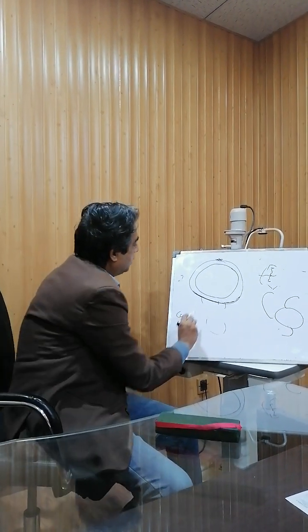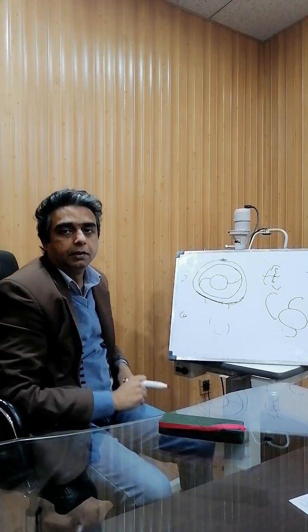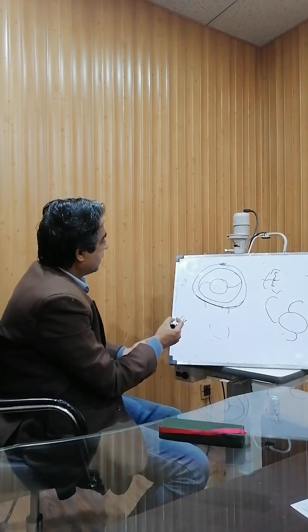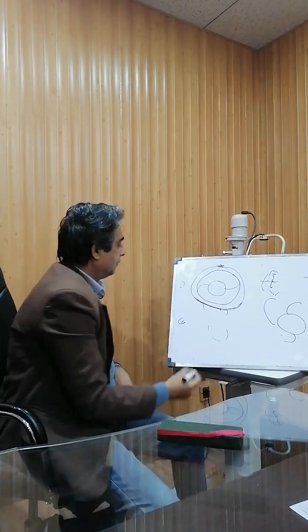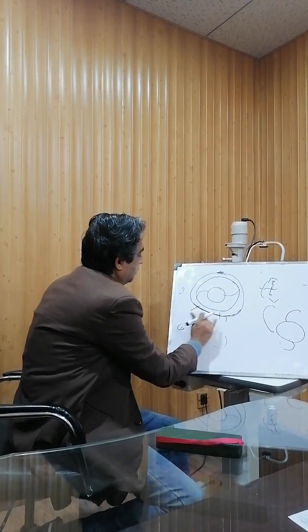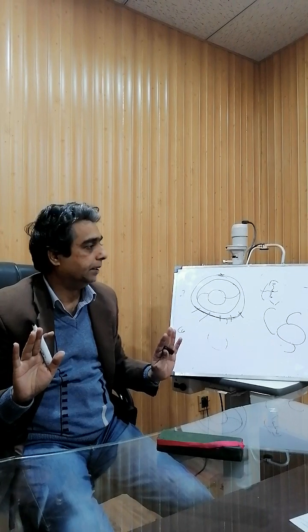We will put this artificial lens into the eye, right? We will put miochol or carbachol, which is parasympathomimetic, like pilocarpine drops. The pupil will constrict and the lens is at its place. Now we will apply 5 sutures. First at 12 o'clock between the cornea and sclera, then here, third one is here, fourth here, and fifth here. That is it. The cataract surgery is complete.